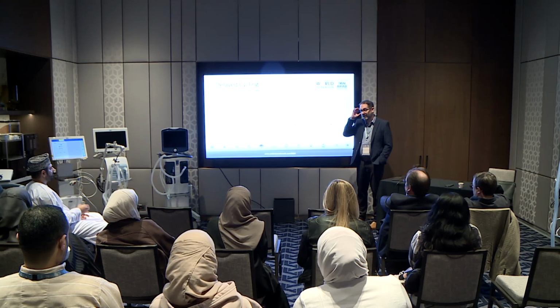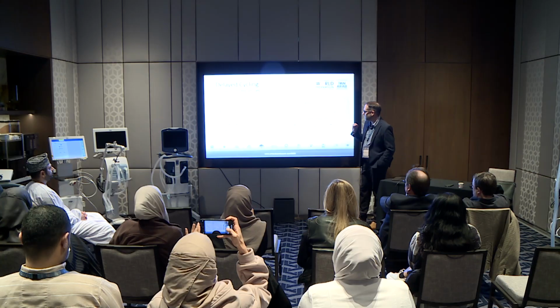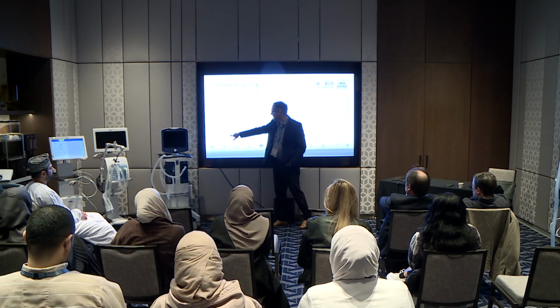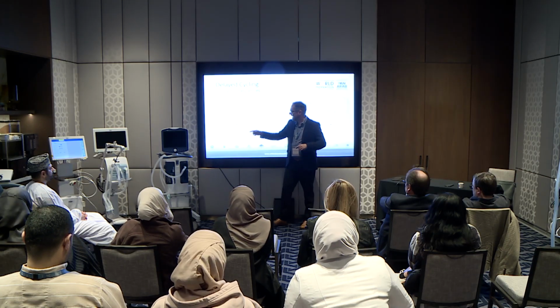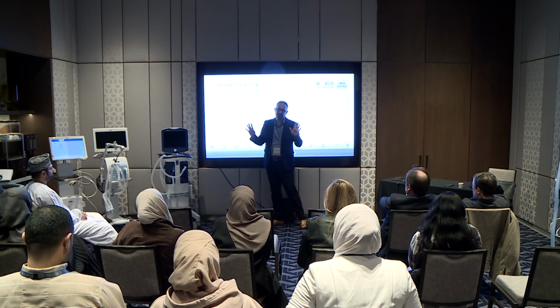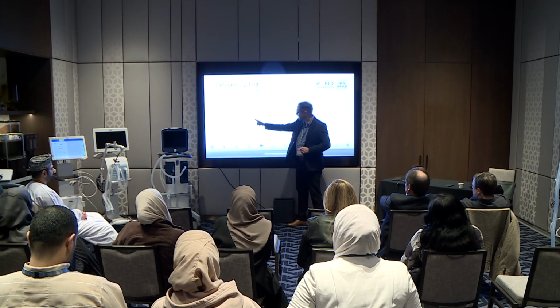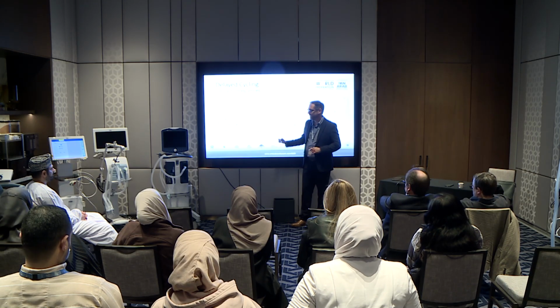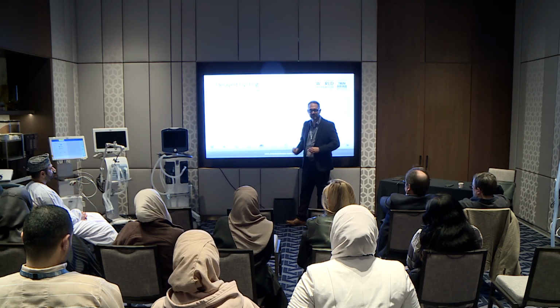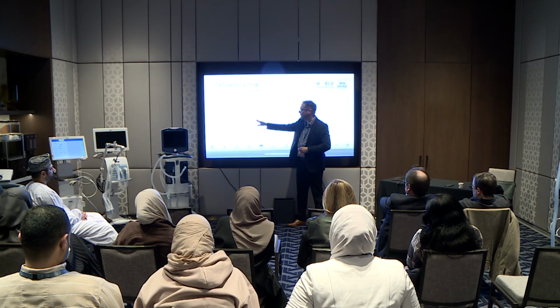Now, I mentioned delayed cycling as a cause of ineffective efforts. This is a great paper by Mike Gentile and colleagues, in Respiratory Care, and I don't have the reference up here. Essentially it describes that the neural inspiratory time is what the patient wants. If your ventilator triggers, delivers the breath, and cycles off at the same time that the brain doesn't want it, amazing, you have perfect synchrony. If the brain stops and the ventilator is still going, again, this is pressure support. In pressure support, we have a cycle percent: 25% of peak flow is when the ventilator decides to stop giving the breath. If it goes on past that, this is considered excess time with flow.